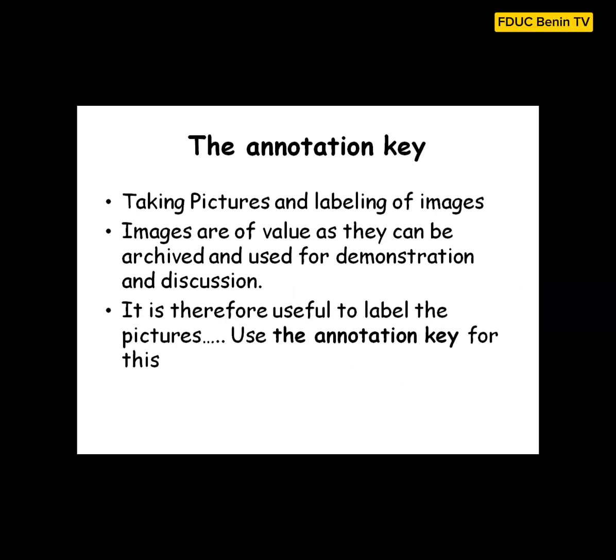The annotation key is another knob that you can use to take pictures and to label, especially when you need to share your images. So you can share them, you can save your images, and the annotation key is what you can use to label or for typing.